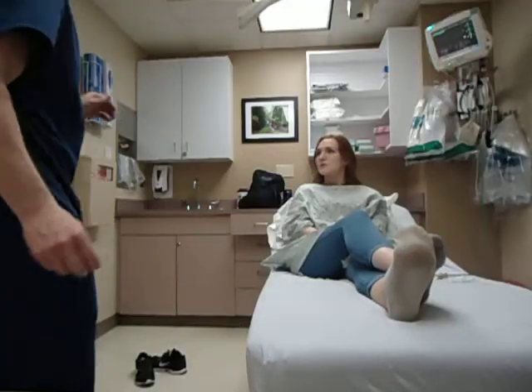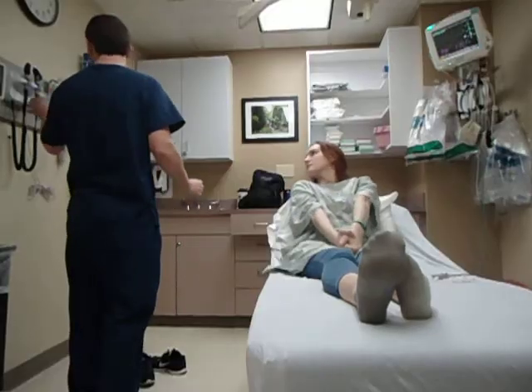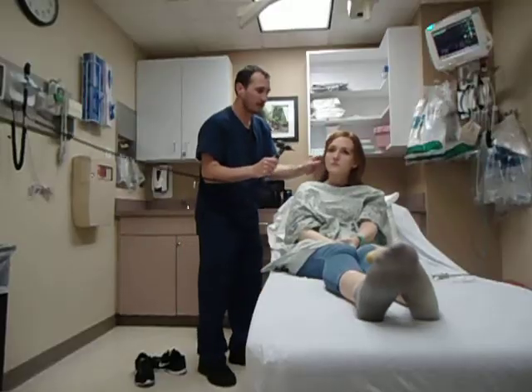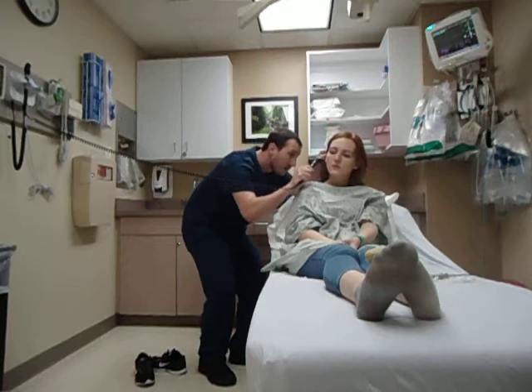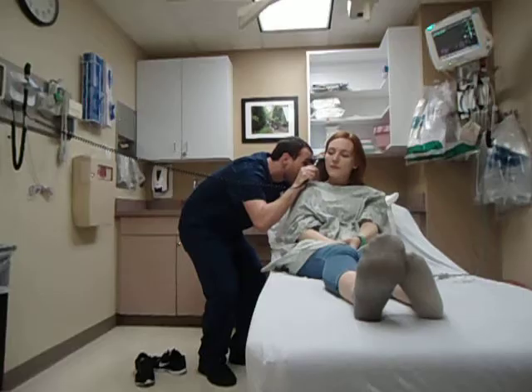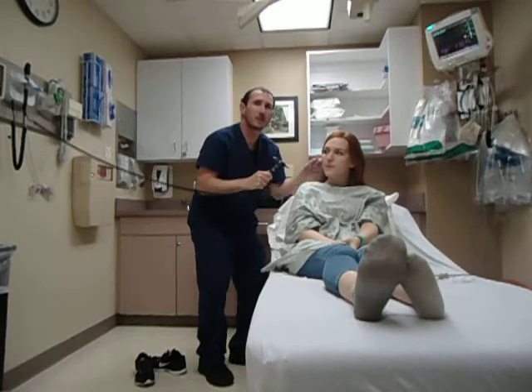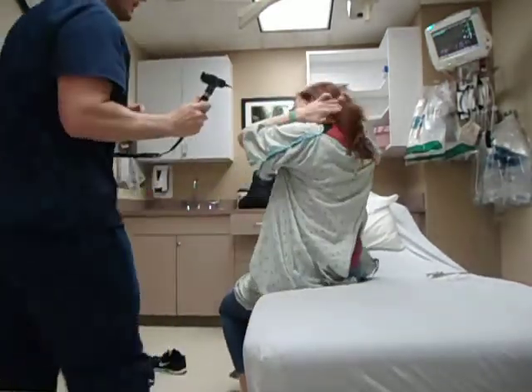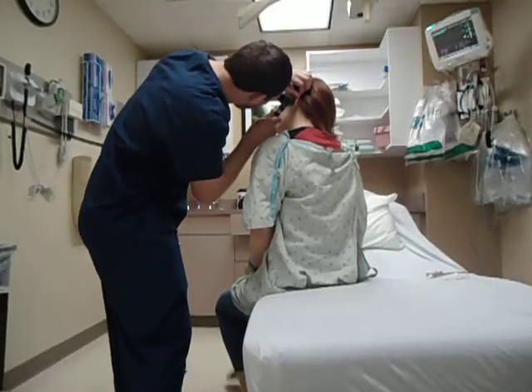I'm going to go ahead and look in my patient's ears. Just look straight ahead. Her ears are clean. Her tympanic membrane is pearly gray with positive light reflex. And I'll do this side here.